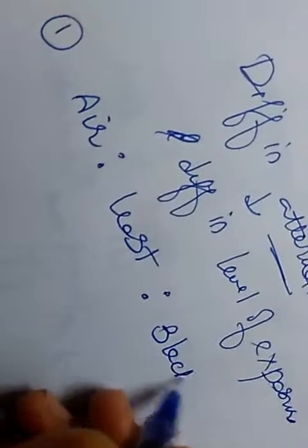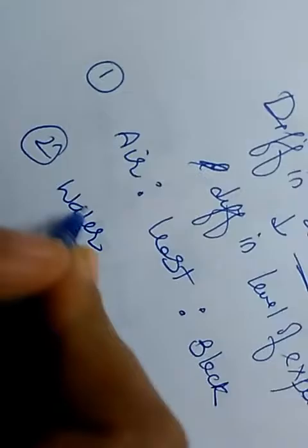Now see, air attenuates the least, therefore it appears black. Then water attenuates more than air, so it appears somewhat gray.